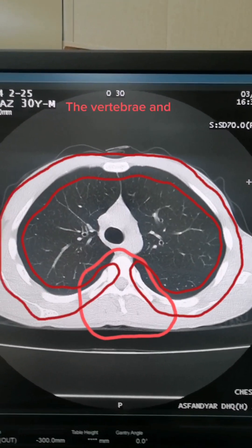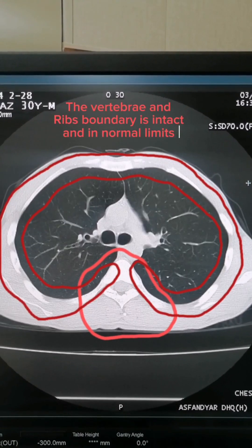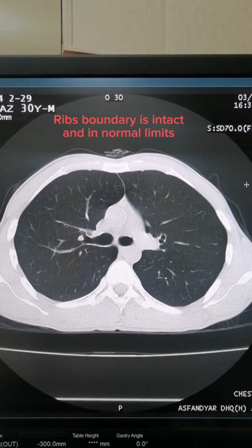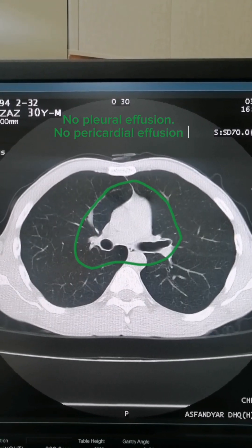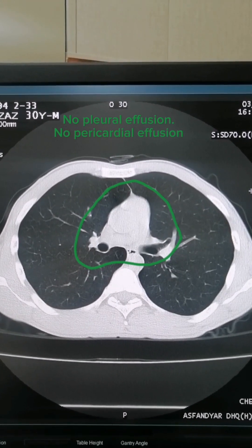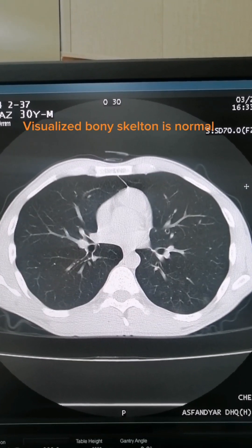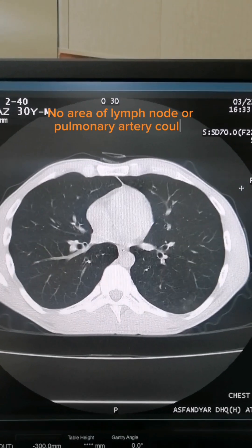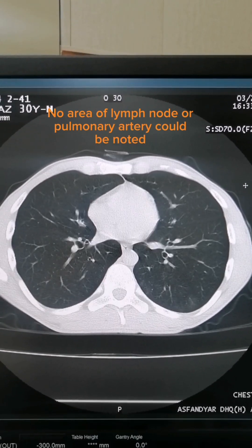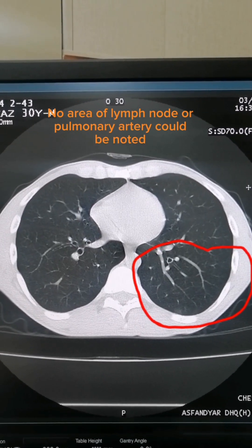The vertebrae and ribs boundary is intact and within normal limits. No pleural effusion, no pericardial effusion. Visualized bony skeleton is normal. No area of lymph node enlargement or pulmonary artery abnormality could be noted.